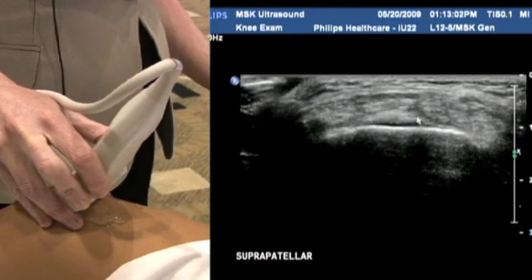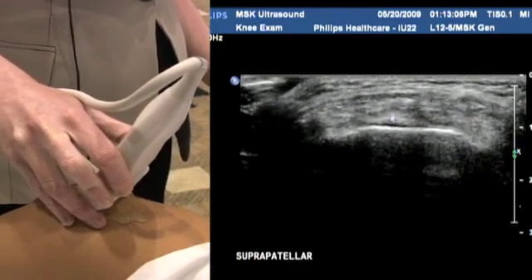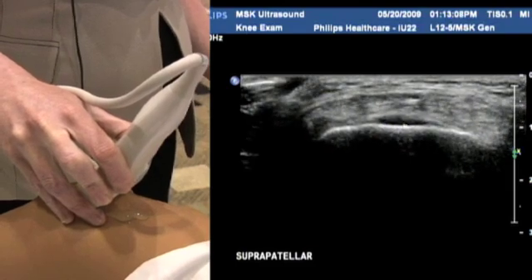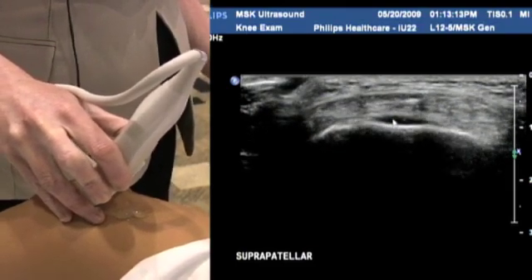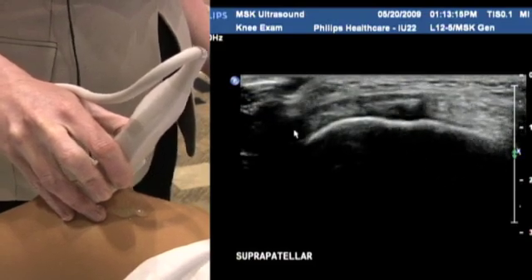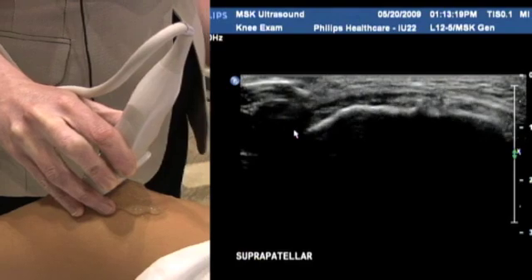You can see that the fibers fill in here and it becomes nice and echogenic, and that's exactly what you're looking for. Underneath you'll see a small amount of cartilage. Again, this is quite normal. Try not to mistake this for fluid. And again, just tracking it all the way down onto that superior portion of the patella.